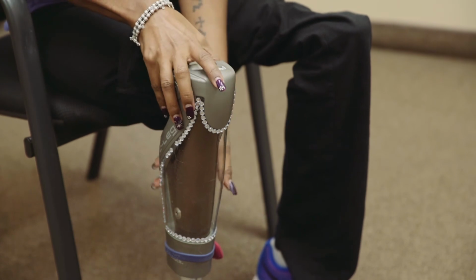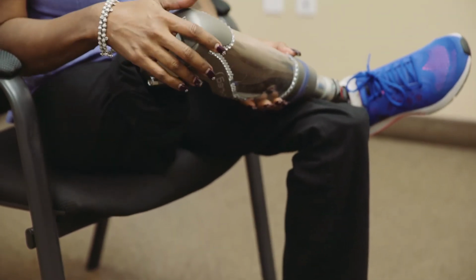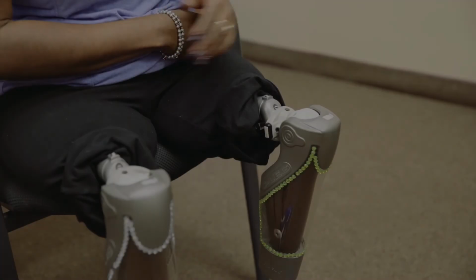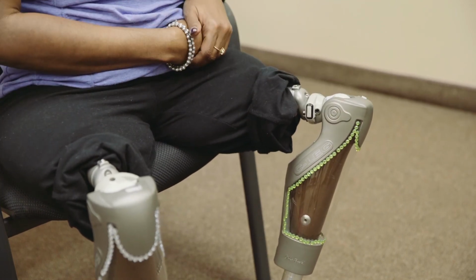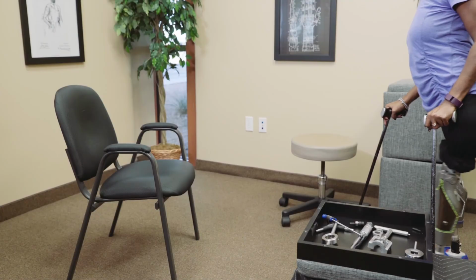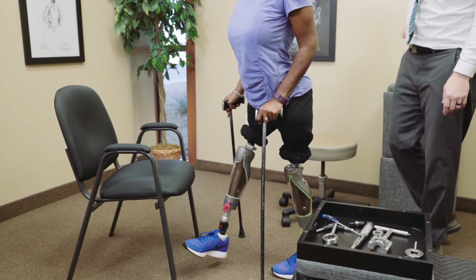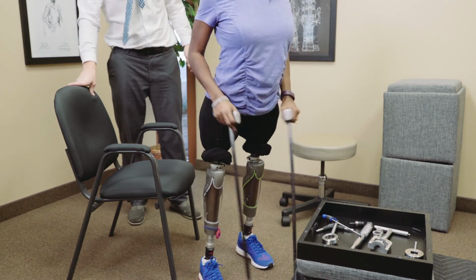For transfemoral amputees, it is highly recommended that a knee rotator is used. This has been proven to reduce long-term pain when sitting with the prosthesis. By pushing the button on the rotator, it releases the small amount of tension that is applied to the hip and implant. It is also highly recommended that transfemoral patients receive a microprocessor-controlled knee. This is for several reasons, but primarily for the added safety that has been proven to come from this type of knee. We hope this video has been helpful in answering any questions or concerns you have had.